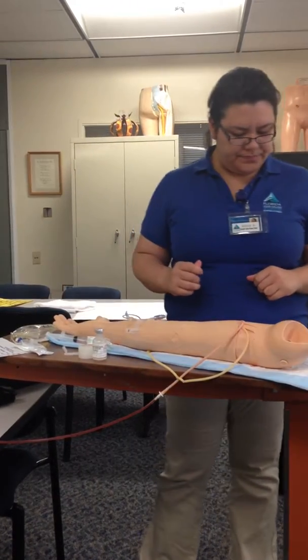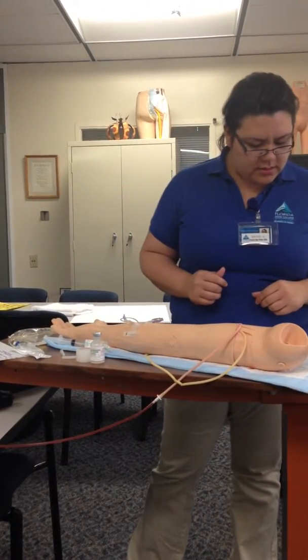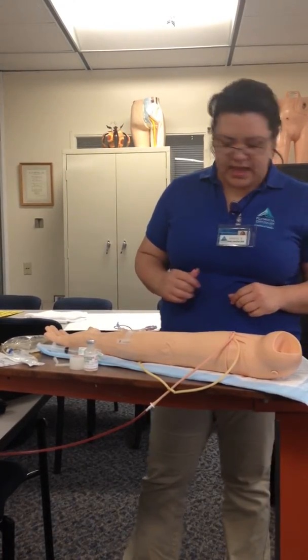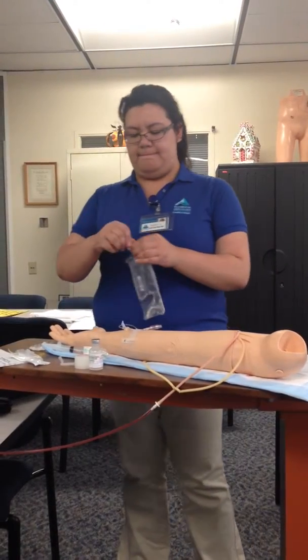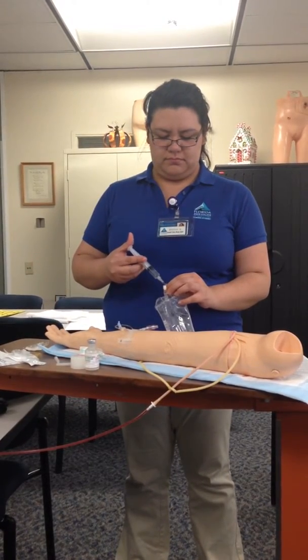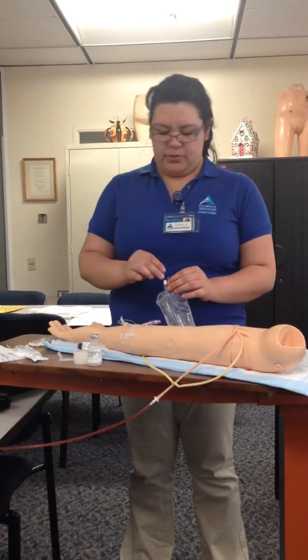And I would add my medication to my bag. Put my blue cap back on.